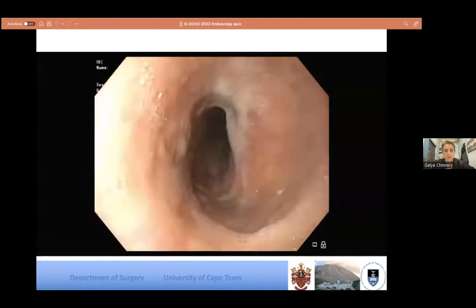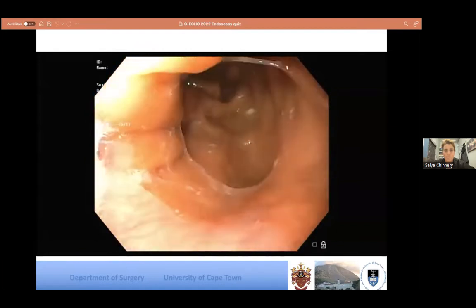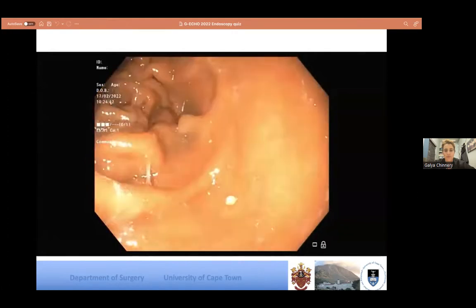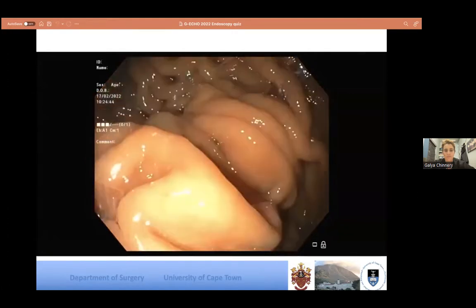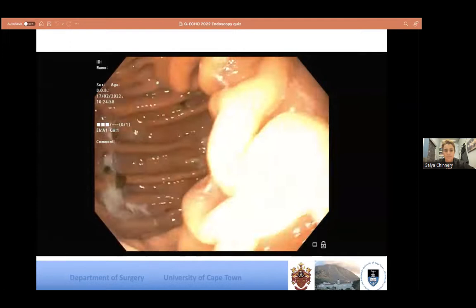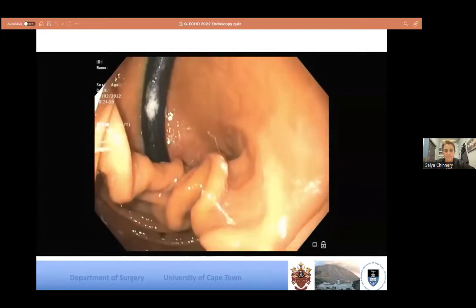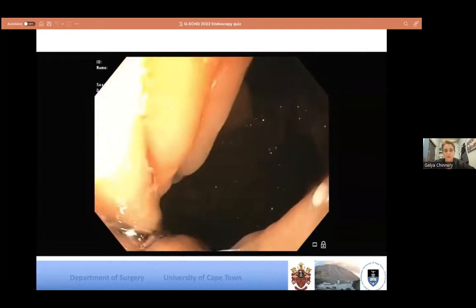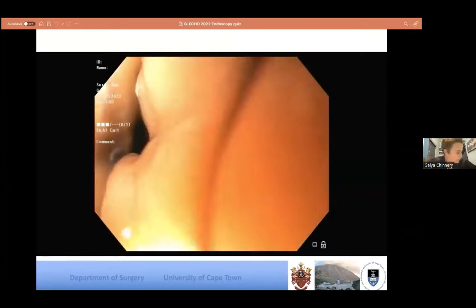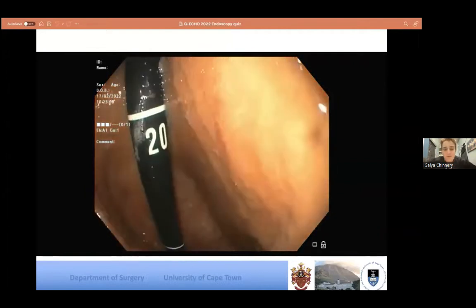So this still looks all right, flying down the esophagus, a bit of saliva bobbing around. Probably OG junction there, Z line. I'll have you know we edited this video. By this time we were sweating. You're trying to look slick and you just can't get to that jolly pylorus. Retroflexing like crazy.